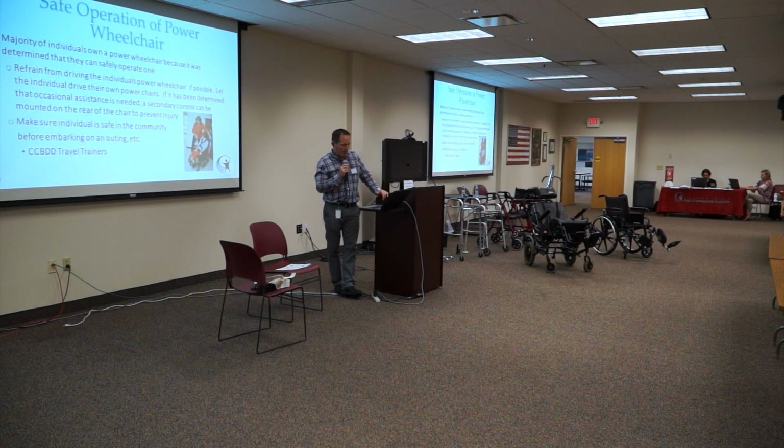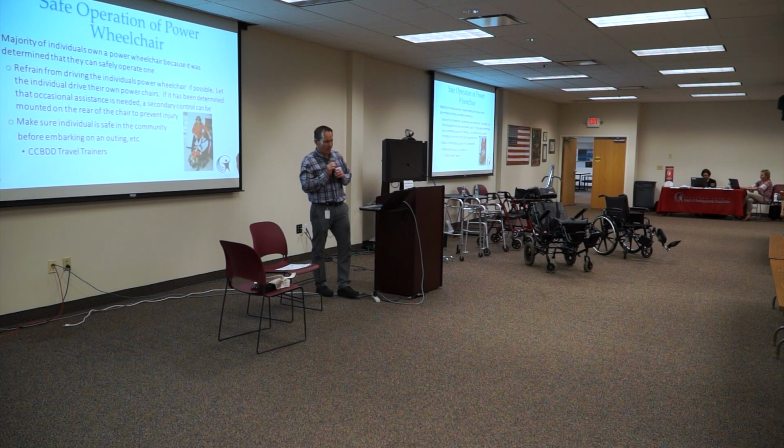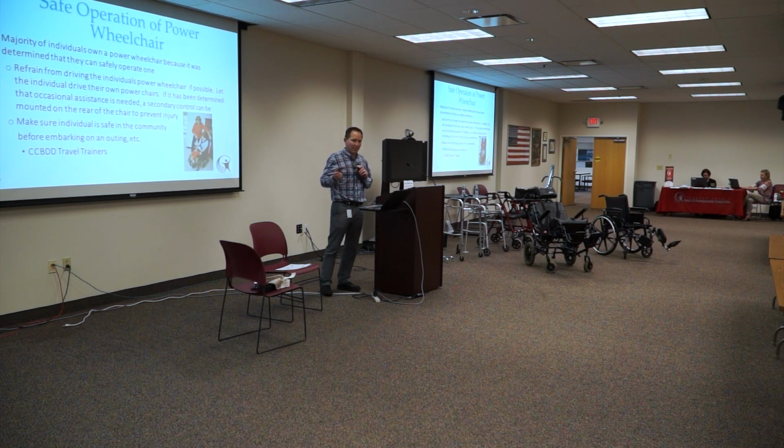I worked at a day program in Portage County for a while, and we would see that all the time. The individual would be late for the bus, and then staff are driving the chair, because they wanted to get them out there quickly. Well, you can run over your foot. 400, 500 pounds is a lot of weight, and that person should be able to do it themselves, or they wouldn't be in it.